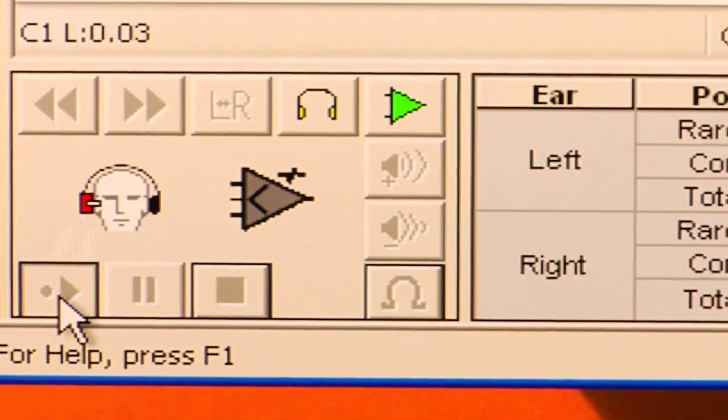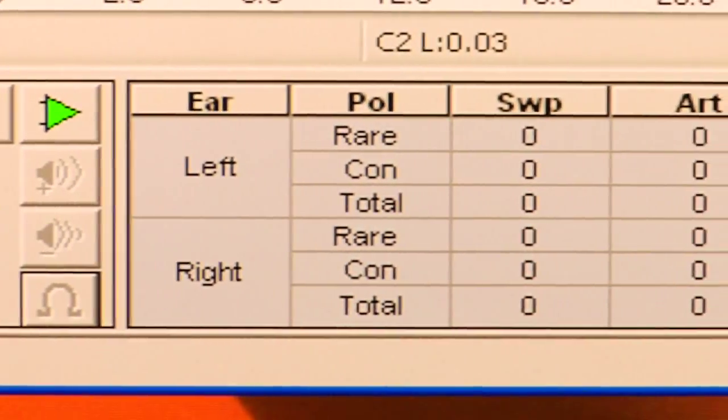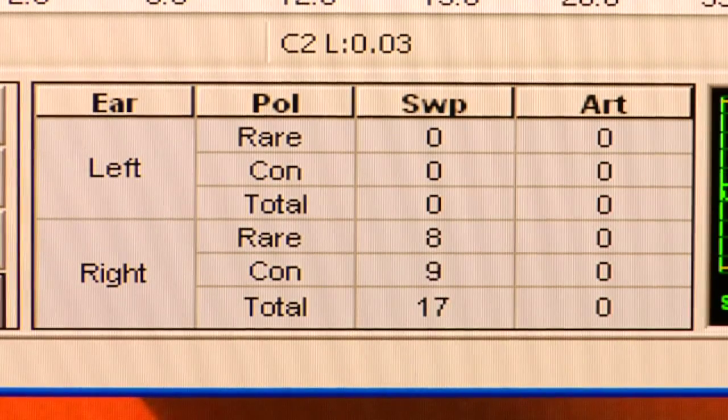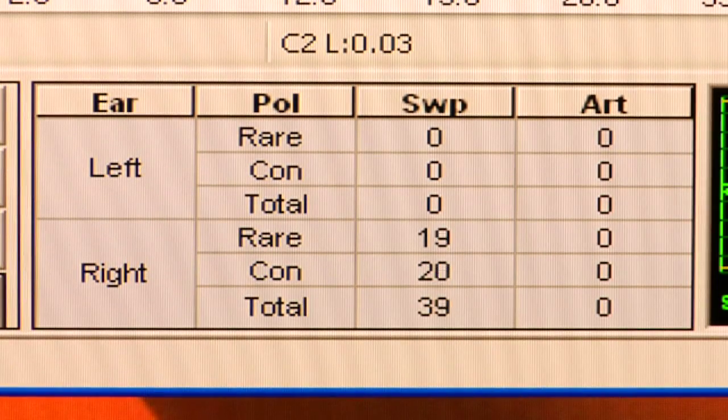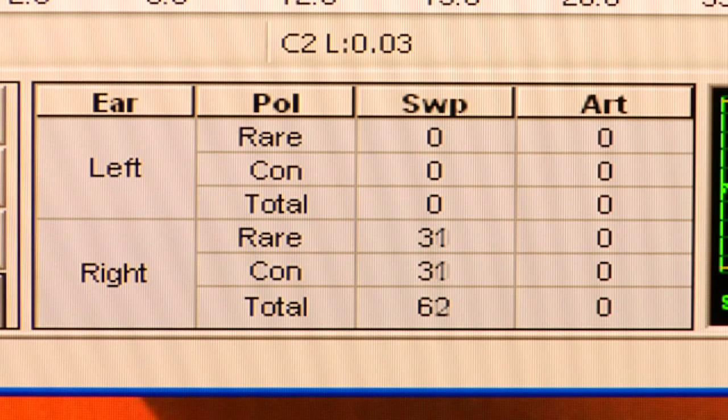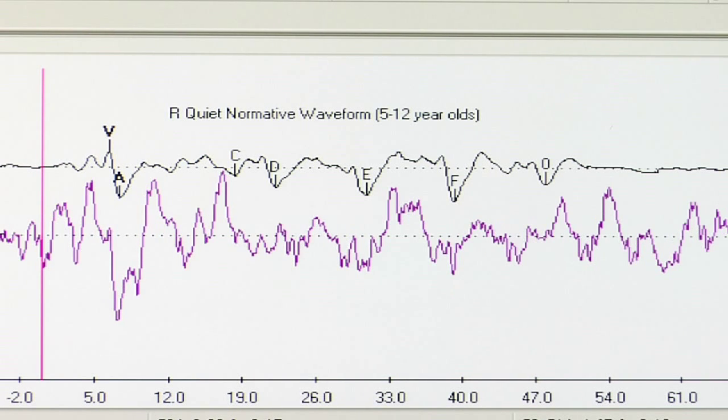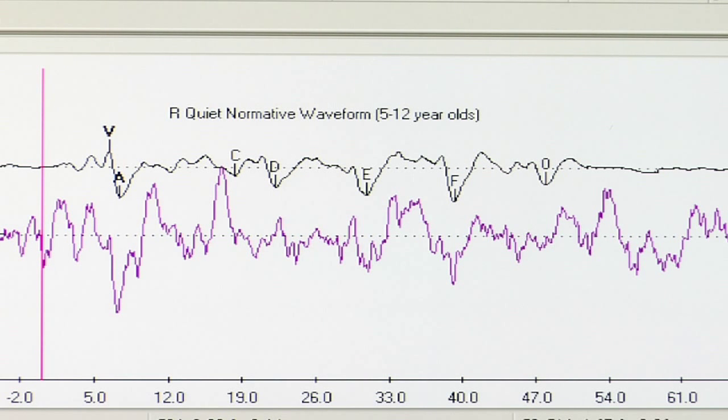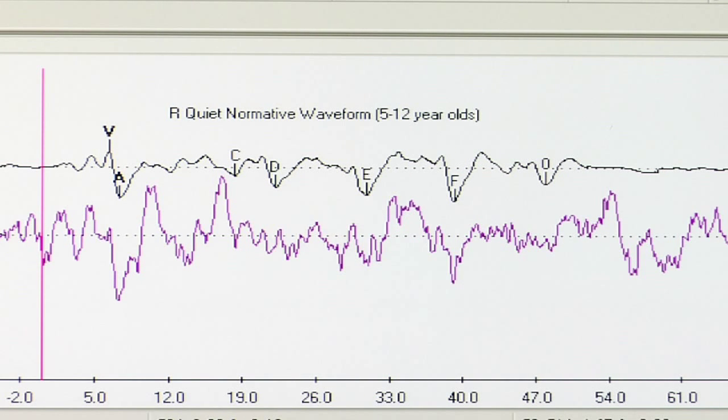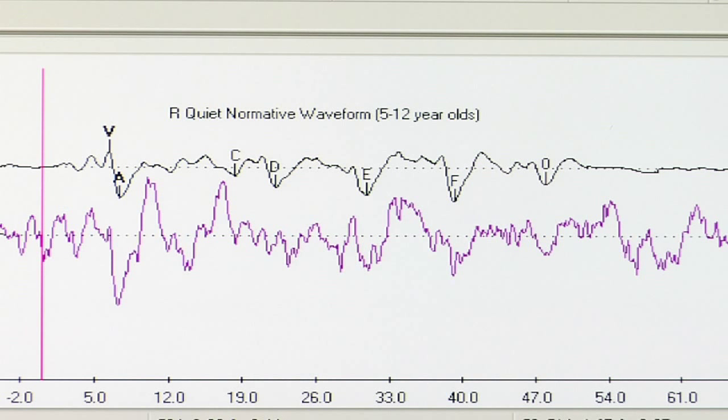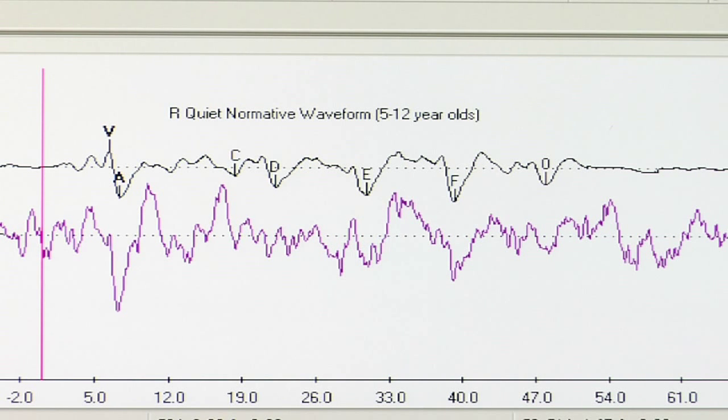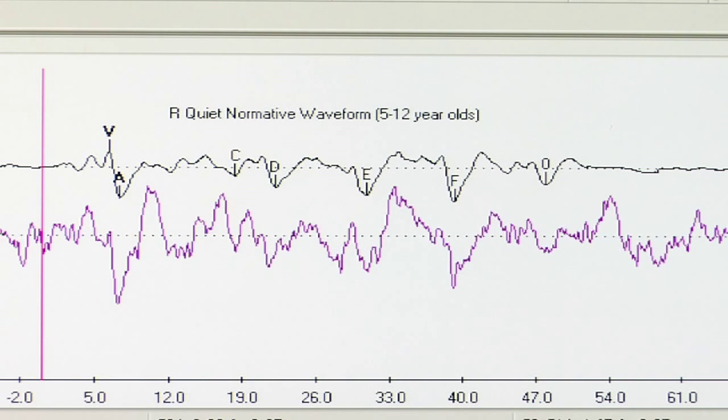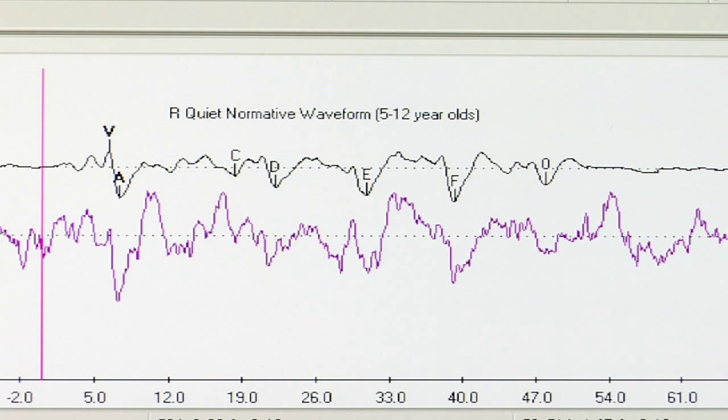You will be collecting two trials of the Biomark responses. Each trial consists of 3,000 artifact-free responses. The waveform that appears represents an average response. While collecting Biomark, you can compare the response to a template waveform. After about 500 stimulus presentations, you will start to see the response take shape.